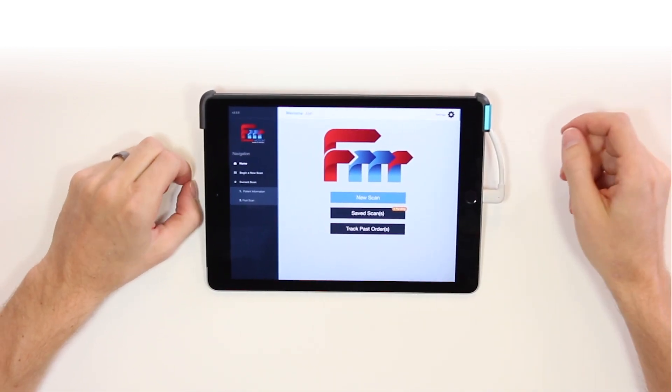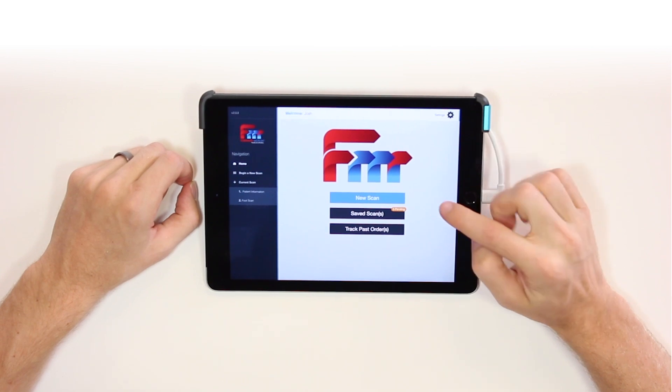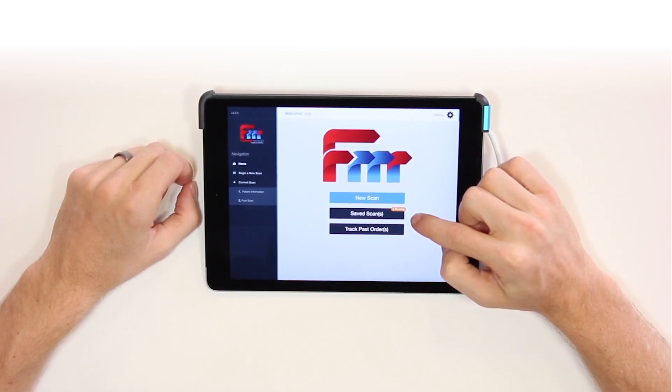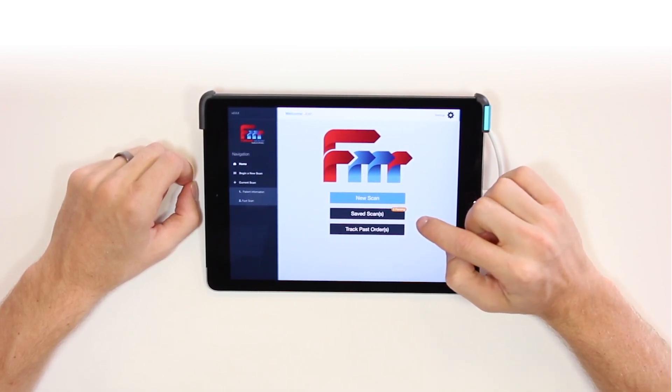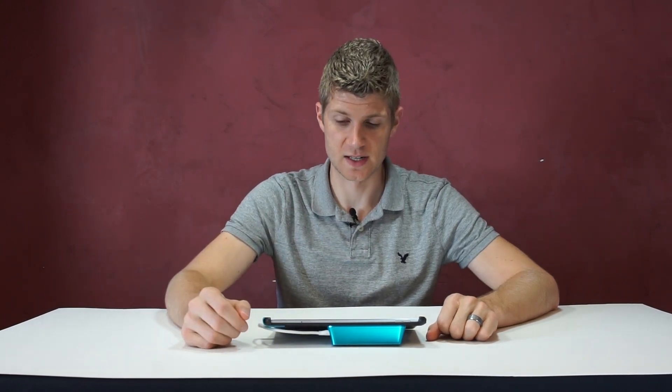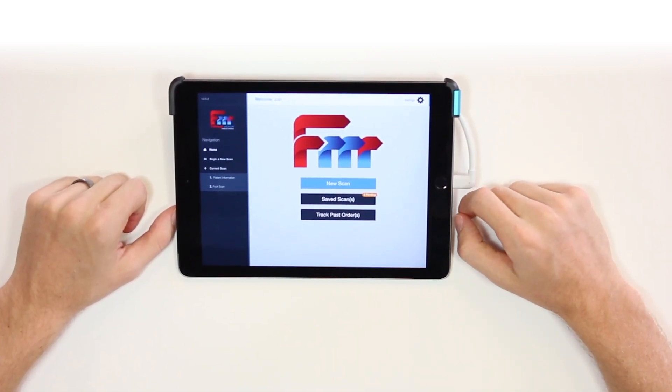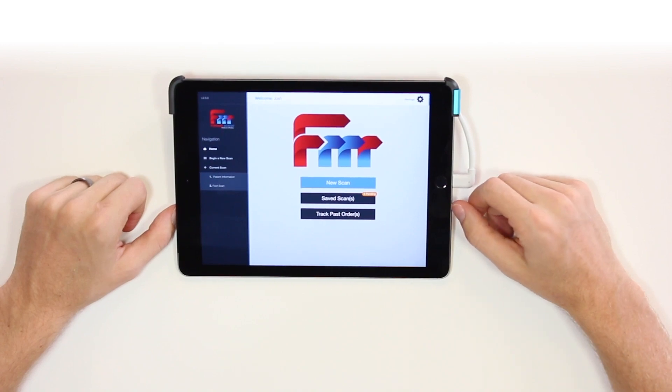When you open it up, it takes you to the home page. You have three options: new scan, saved scans, and track past order. New scan is obviously how we start a new scan. Saved scans is a folder that holds all the scans you've taken and all the scans you've sent, so if a patient is unsure if they want orthotics or you're waiting for insurance clearance, you can keep the scans on your iPad and send them when you're ready. The track past orders button logs you onto our database — it won't be active until you've sent your first scan and called in to get a username and password. It will show you where your orthotics are, give you tracking numbers for shipping, let you see PDFs of your prescription forms, and reorder second pairs.